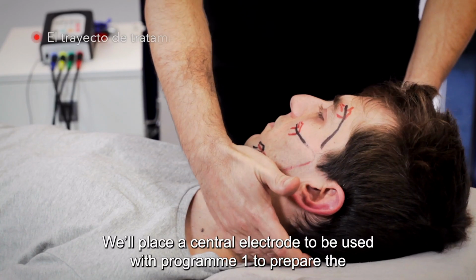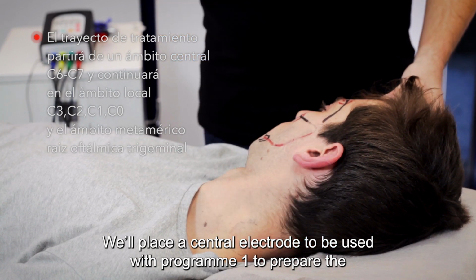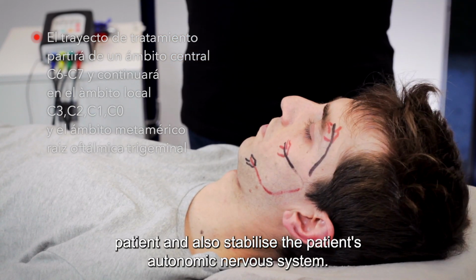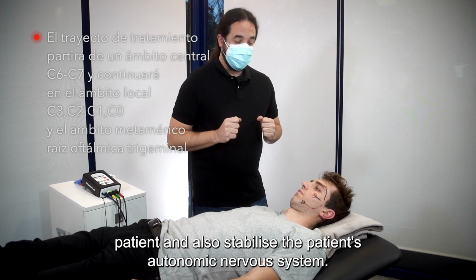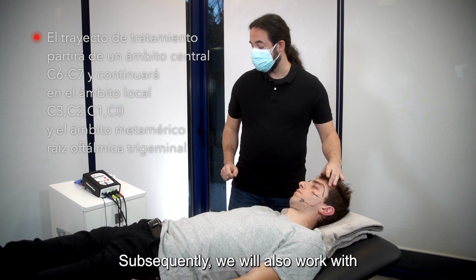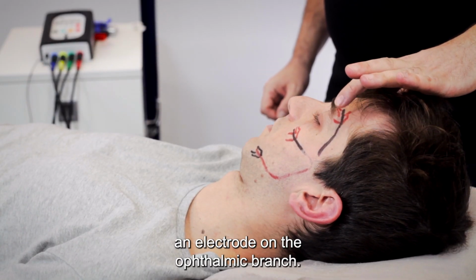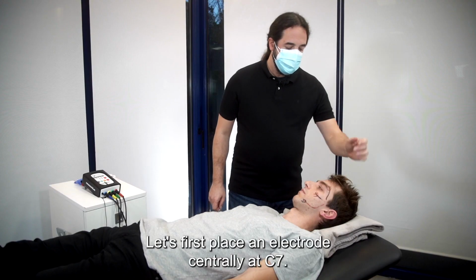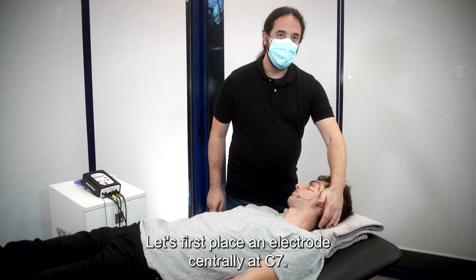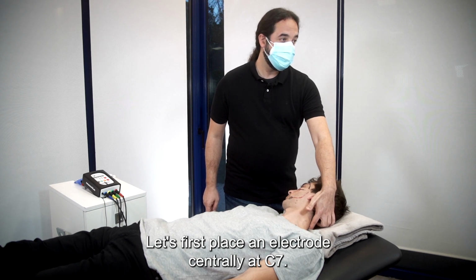We'll place a central electrode to be used with program 1 to prepare the patient and also stabilize the patient's autonomic nervous system. Subsequently, we'll also work with an electrode on the ophthalmic branch. Let's place an electrode centrally at C7.